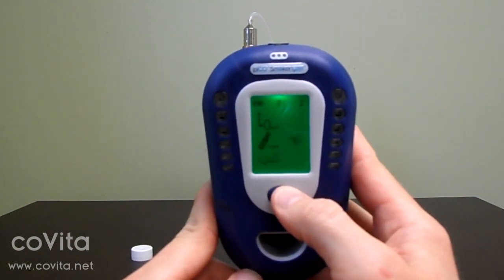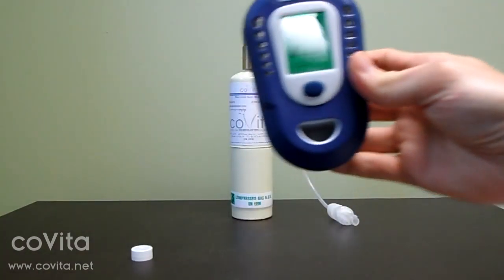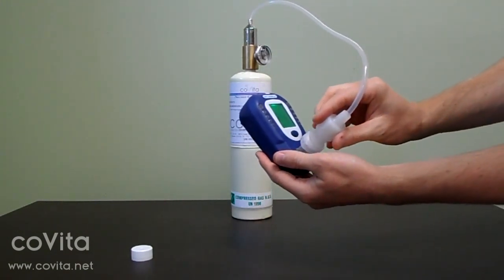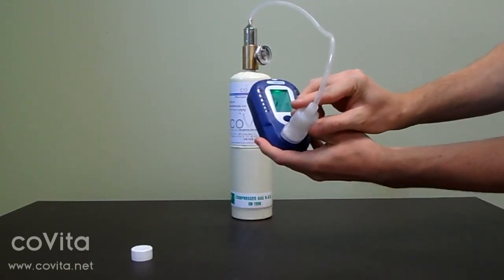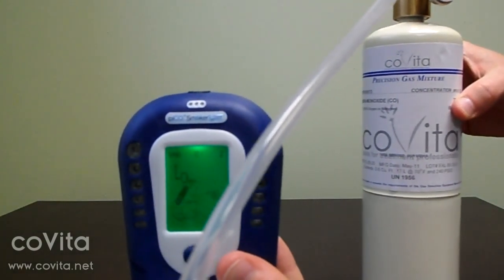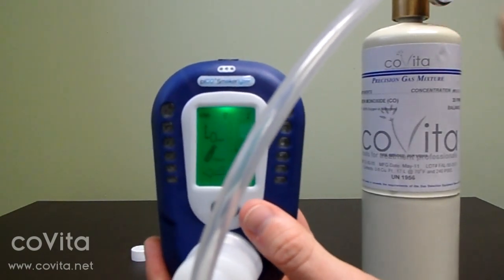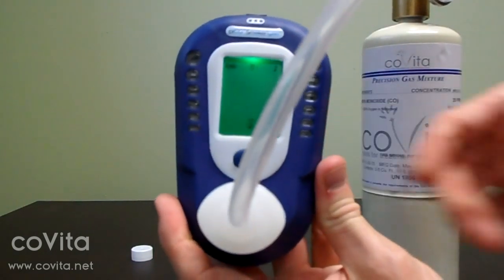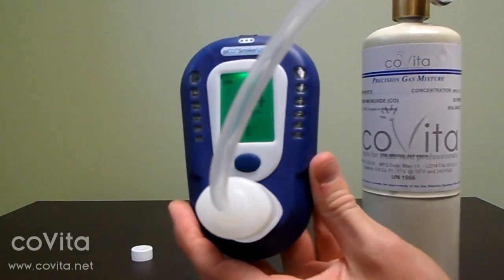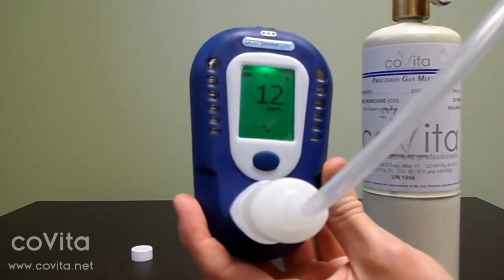Single click to scroll down to the can of gas. Connect the D piece to the monitor. Double click to select the gas icon and begin calibration. Immediately turn on the flow of gas.